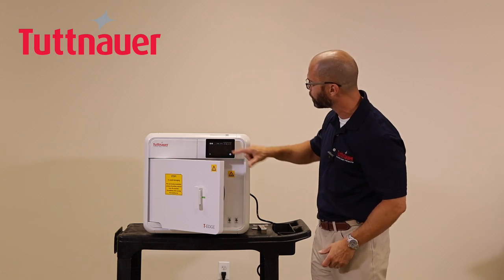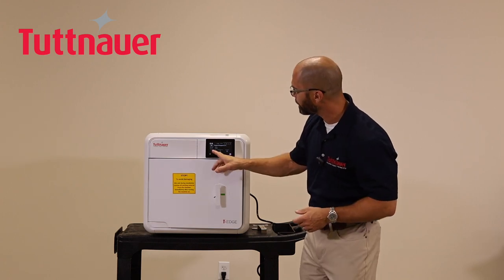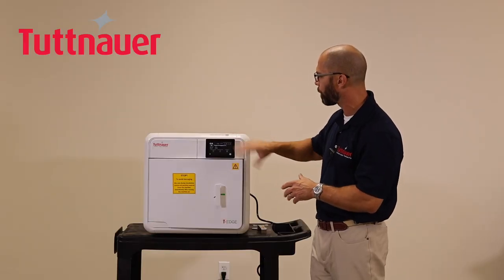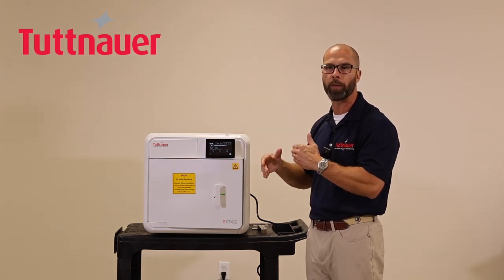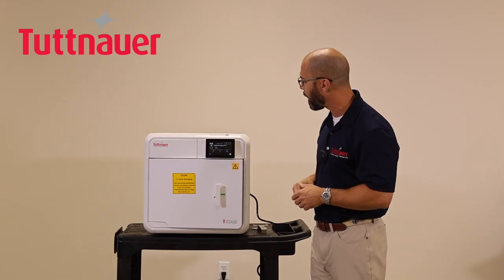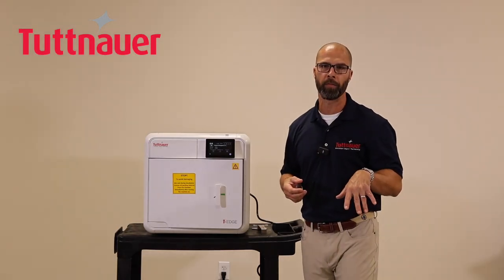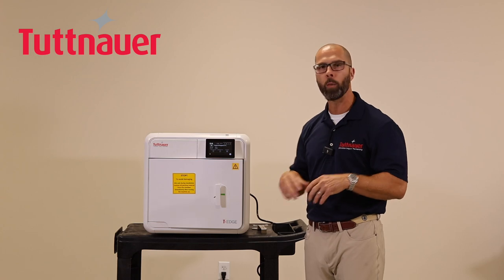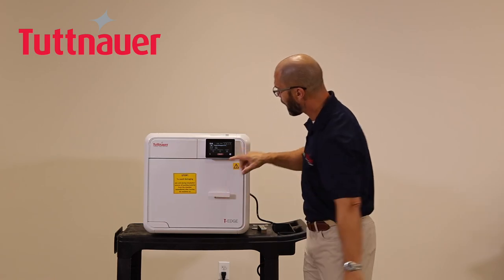After selecting a program, a final screen shows the cycle time and a countdown clock visible during operation. At this stage you can also customize the program by adding drying time. There is also a proprietary VirusProtect option — a Tuttnauer exclusive — and a link at the bottom of this video provides more information about it. Once ready, close the door and press Start.